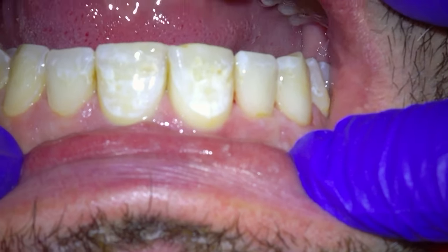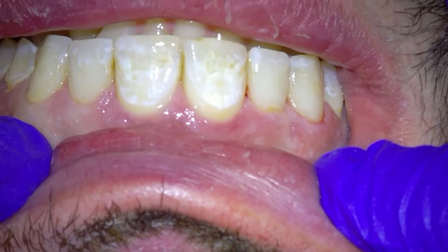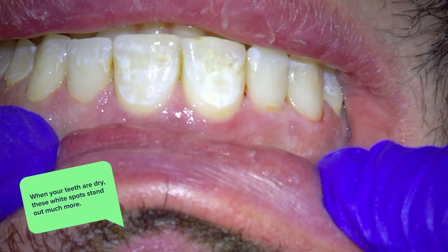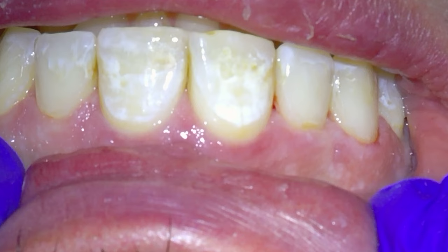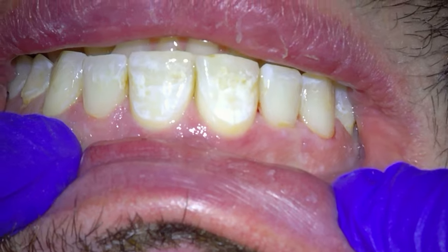Now I'm going to show you two different results for this procedure. The first is at the end of the appointment — I show this to the patient and he's very happy, except now he notices much more the other white spots that aren't cavities on the other teeth. It's worse than just seeing the white spots because when teeth get dry, these white spots stand out much more than when wet. His teeth are really dry now because he's been open so long and we've been drying the tooth off throughout the procedure, making those white spots extremely noticeable, even ones that were imperceptible before we started.